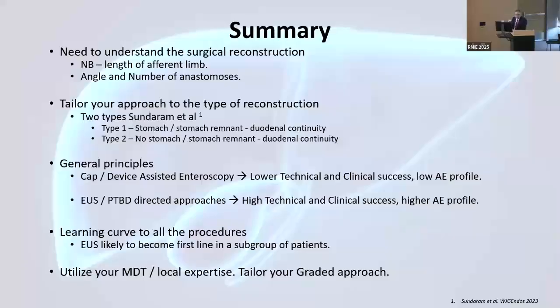The general principle to take home is that device-assisted enteroscopy has a lower technical and clinical success rate compared to the more invasive approaches, but has a very favorable side effect profile. And your more interventional approaches, EUS or transhepatic routes, have a very high technical and clinical success rate, but come with a higher complication profile. There is a learning curve to all these procedures.